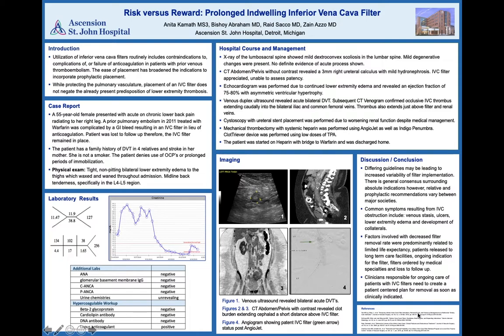Multiple studies have shown that having dedicated personnel responsible for developing a database and arranging for follow-up appointments is effective in enhancing filter removal. Providers and patients need to both accept accountability and adhere to an agreed-upon plan of action.